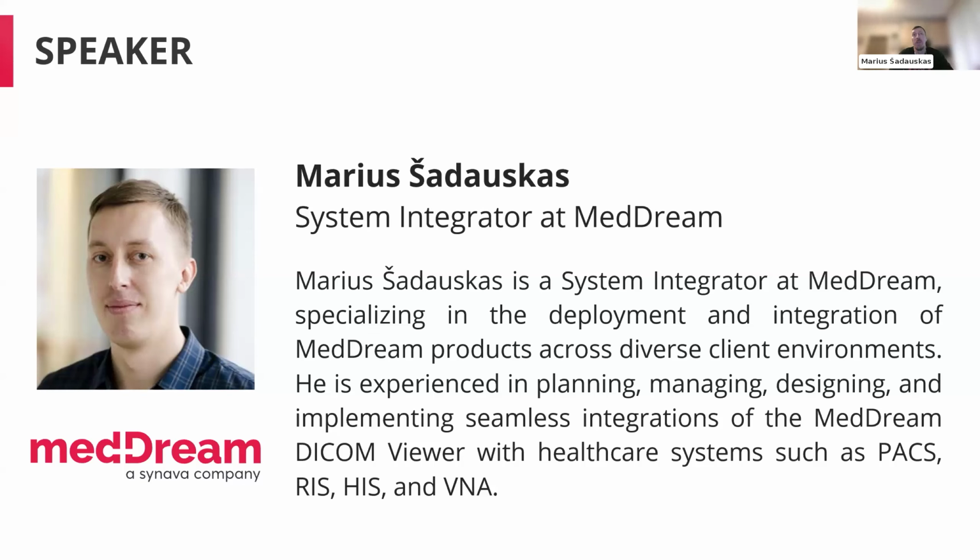In this webinar, Reid will present their solution and demonstrate the integration with the MedDream Viewer. I'm very excited to see this, and I wish you all a great and informative webinar. I hope it will be useful for you. So Reid, I am passing the word to you.